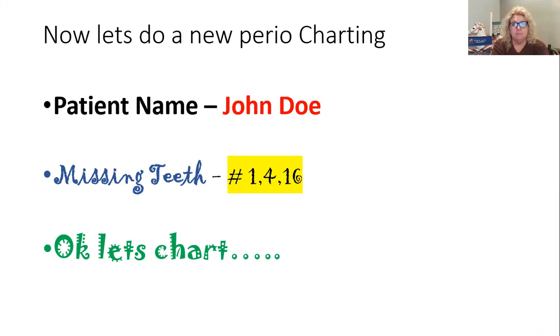Where am I? So you should have said distal lingual 22. And if you're not there, get there. Distal lingual 22. 3, 2, 3, 2, 2, 2, 2, 1, 2, 2, 1, 2, 2, 1, 2. Where am I?